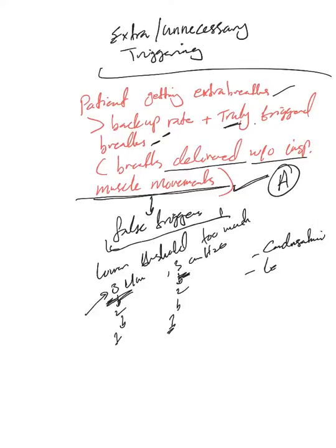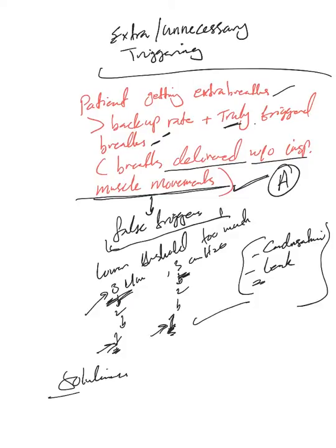or a leak. Because of this very low threshold, you can simply reach these values and the ventilator mistakenly senses, oh, the patient is trying to breathe, and they're not. It's because of some problem in the circuit, and the ventilator will go and deliver the breath. Simply, the solution here is, as you can guess, increasing the threshold.